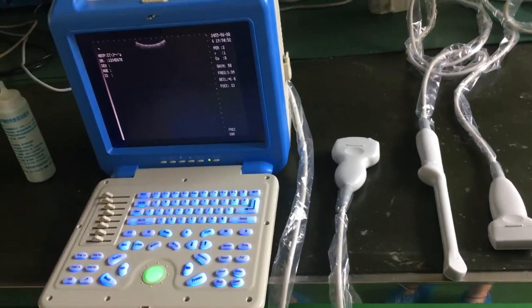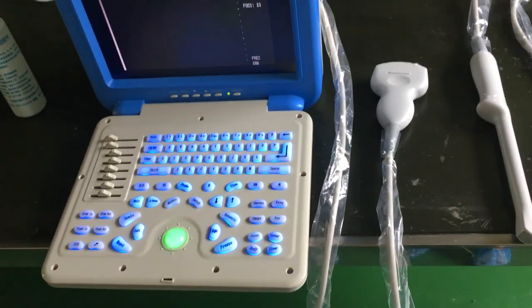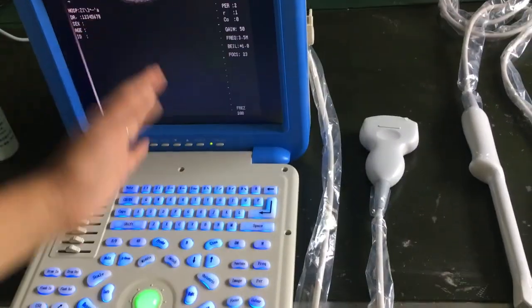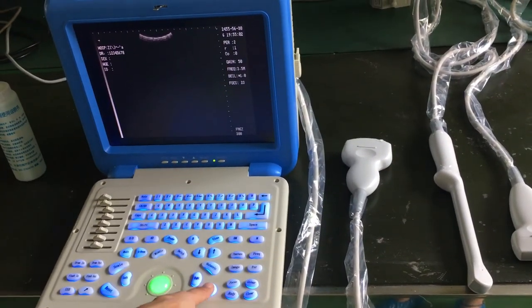Our keyboard is in English. Let me show you — you can see now it is in B mode.